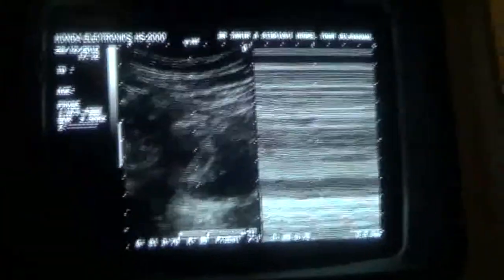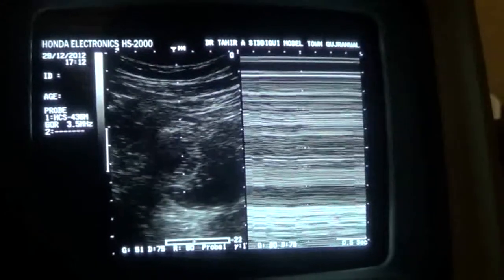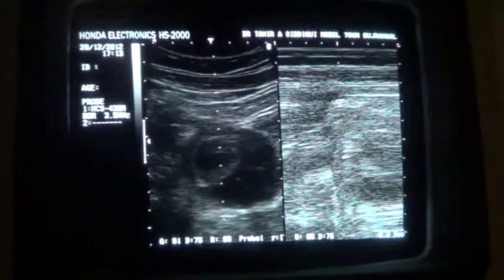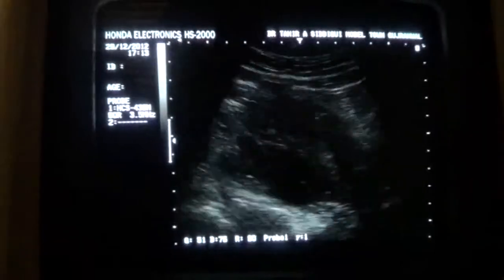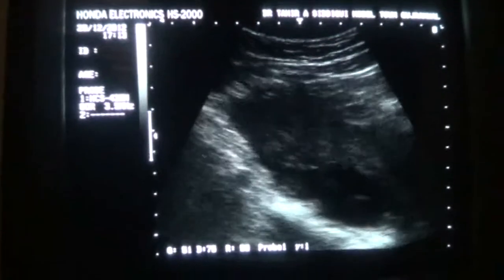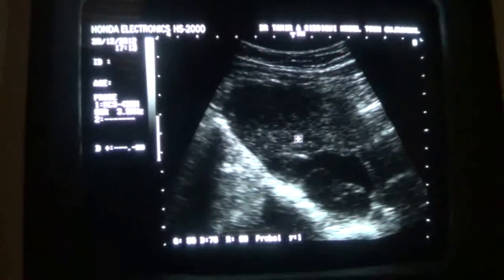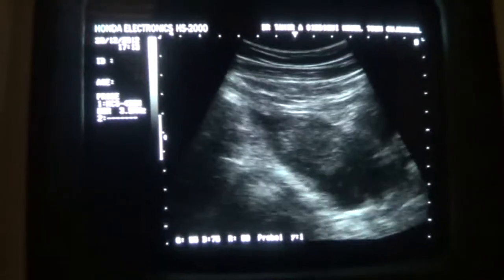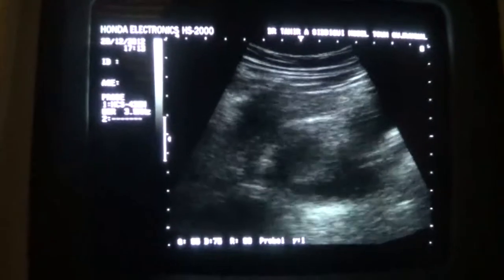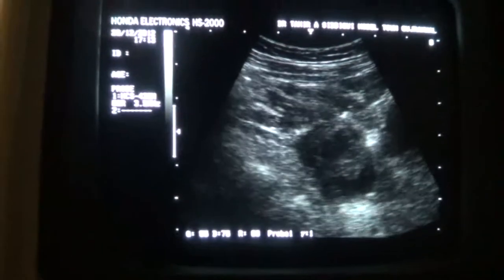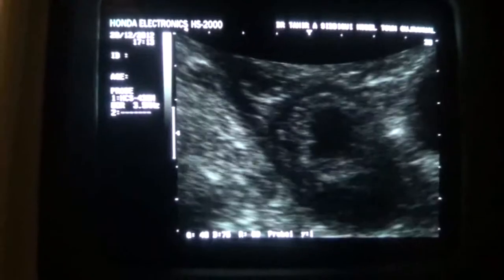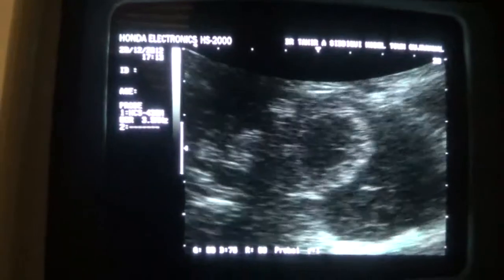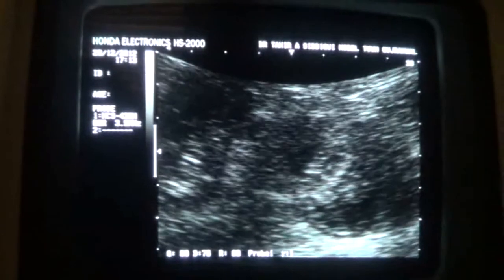So this is a case of extra-uterine, 7 to 8 week ectopic and ruptured pregnancy. See the fluid — there is a large amount of fluid in the pelvic cavity. This is the uterus, and here comes the sac within the pelvic cavity, surrounded by fluid on all sides with fetal pole seen within it, showing cardiac activity.